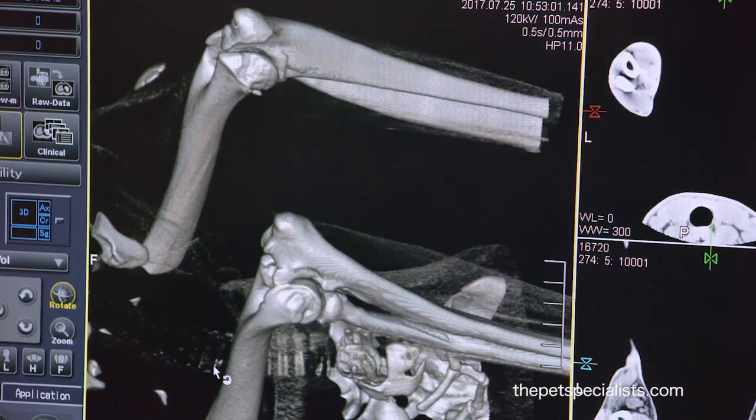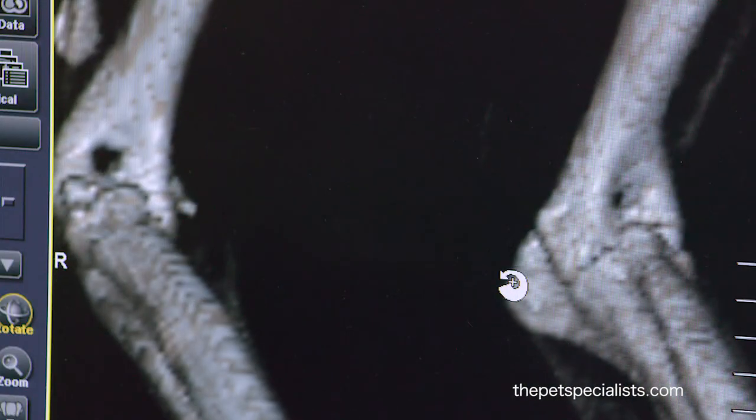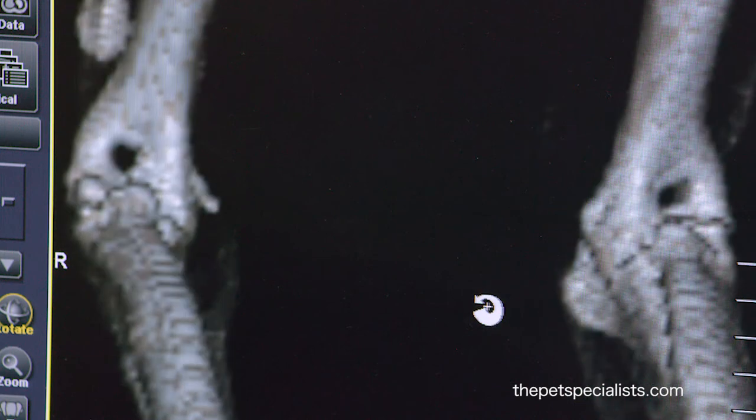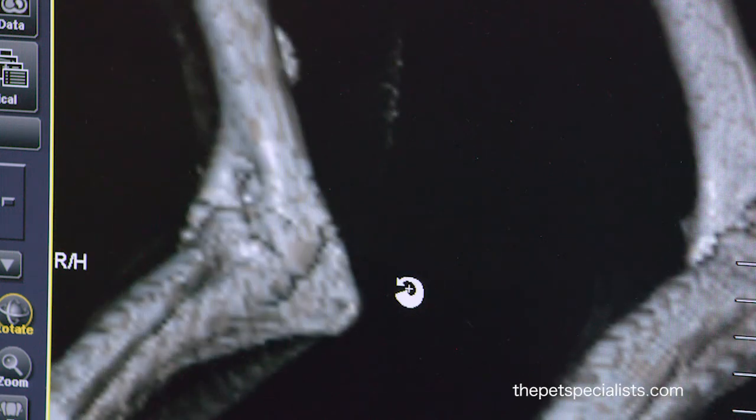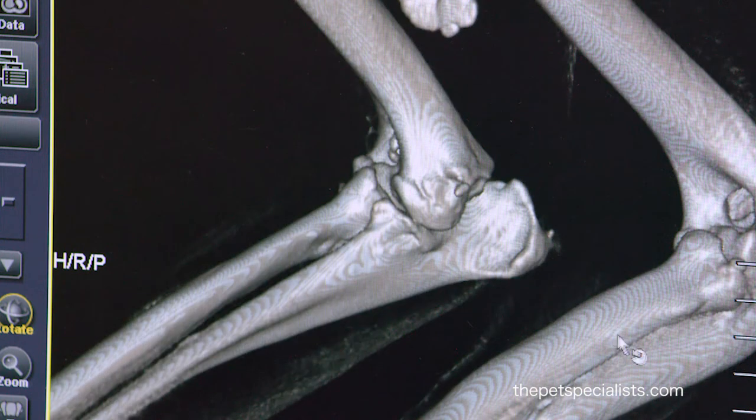We're looking for a fragment in the coronoid process, which is a chip fracture off of the ulna. These fractures are often one to two millimeters — sometimes half a millimeter — and so impossible to image with anything other than CT.